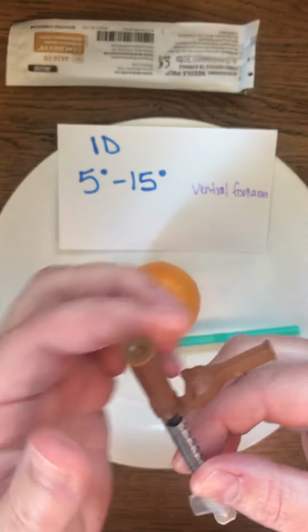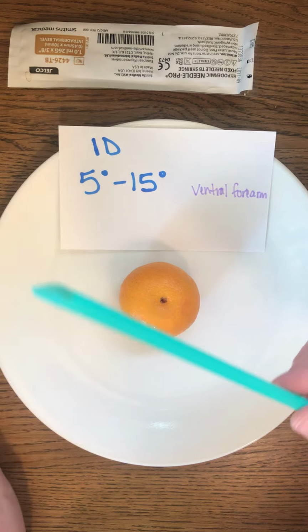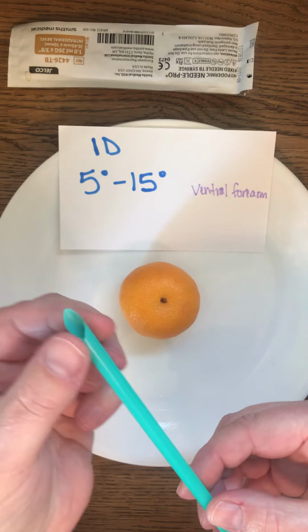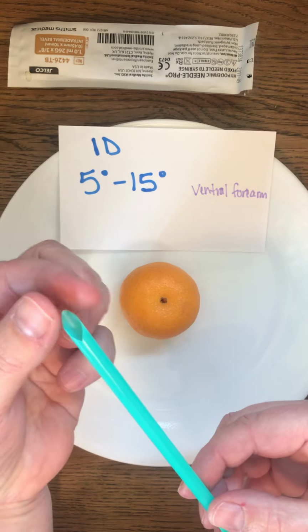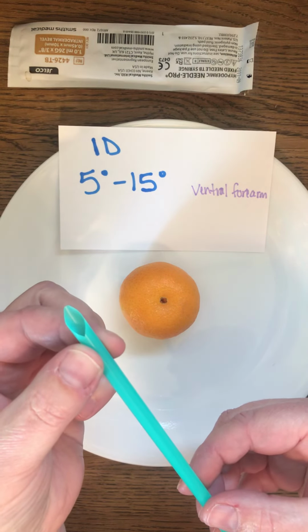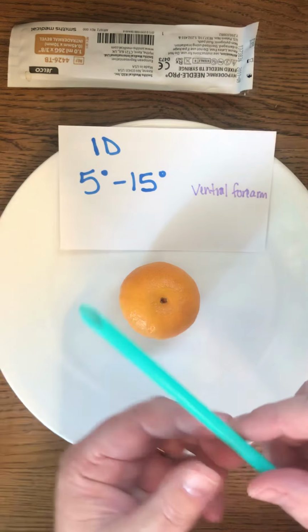We've talked about having a bevel before, and in order for you to visualize this a little better, I cut a straw so that you can see. This is how our needles look. Our needles are tapered off and pointy on the one end. When you are administering an injection, especially an intradermal, you want to inject bevel up, which would be like this.